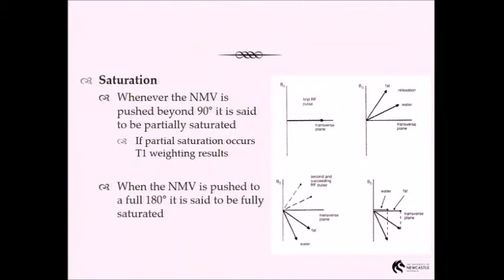They had parts of their images where they'd actually pushed the vector to line against the field, no signal. So even though it's something that you don't think about a lot when you're doing clinical imaging, sometimes there might be times when you might want to think about saturation effects. And again, there's an equation which will tell you about this. You don't have to remember it. It's called the Ernst equation. You can feed in some parameters, and essentially it tells you the ideal flip angle to use for any given MR experiment.